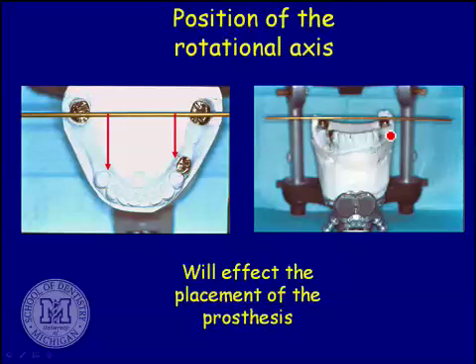Because let's say with a conventional class 3, in this situation right here, you've got 4 sets of clasps all grabbing the teeth. And so as far as how tight this thing is going in, can you see both seating it and taking it out? You're working against the retentive features of 4 different clasps grabbing the teeth. People follow that okay? If it's a rotational path, and literally when people toss them in, after about 2 days, they get real used to just sort of feeling how it goes in. Because it's not that it's a lot harder to put in, it just doesn't go absolutely straight down. They've got to consciously just let the back part seat and push the front part down.